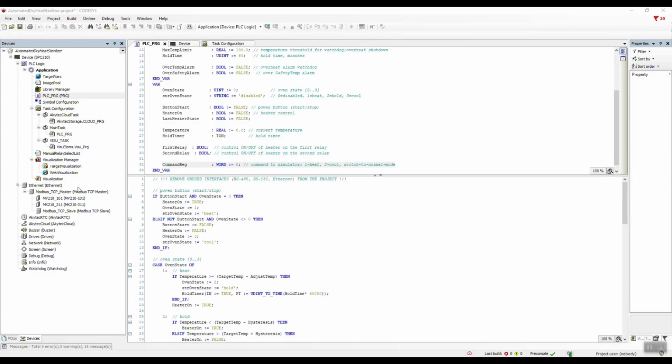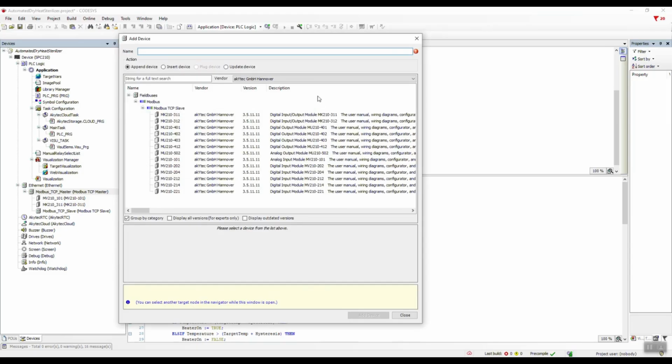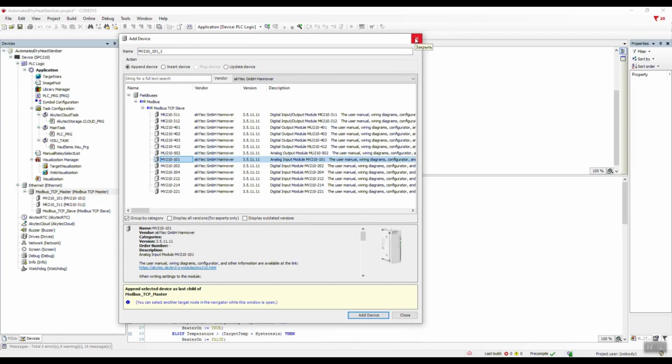Now let's set up polling of the mentioned modules using the Modbus TCP protocol. In my project, this is already configured, and it's done using templates. To add templates to the Modbus TCP master component, you need to right-click on it and use the Add Device command. You can use the manufacturer filter to see only the devices you're interested in. Let's add the template for the MV210101 module, the analog input module.